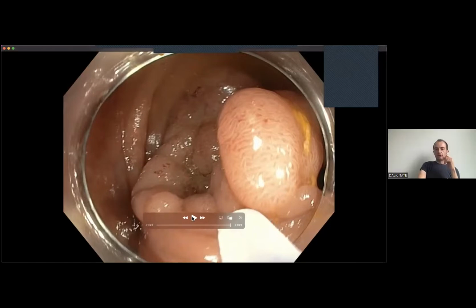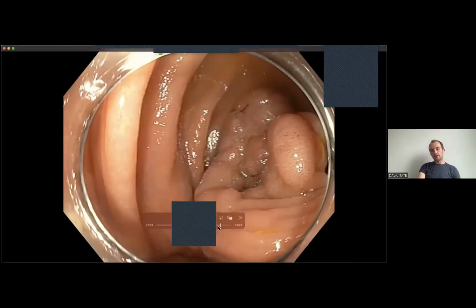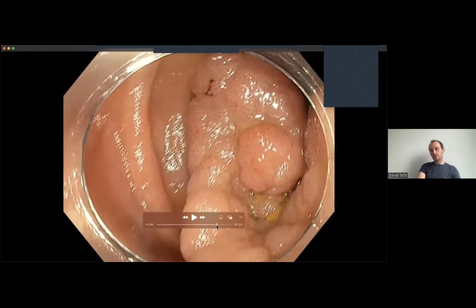Okay, so lots of great things in there, and some things which are not quite right. You said to me the size is about 30. I think that's right. You said to me that it is granular. That's absolutely right. You said to me it is Paris 2A. Everybody knows the Paris classification. In a minute, we'll share with you a slide of the Paris classification, but it probably has some nodules in it. Can I convince you of that? Some things that are a little bit higher than the background. So in fact, that would make it 2A plus 1S, the 1S part describing the nodules.